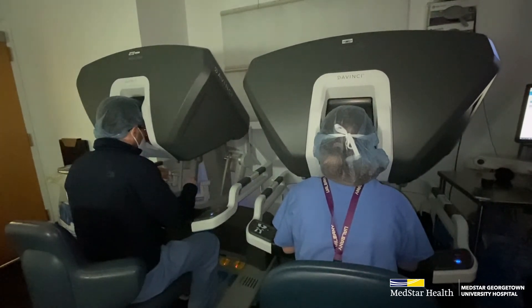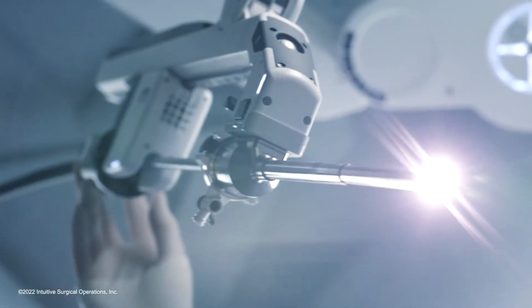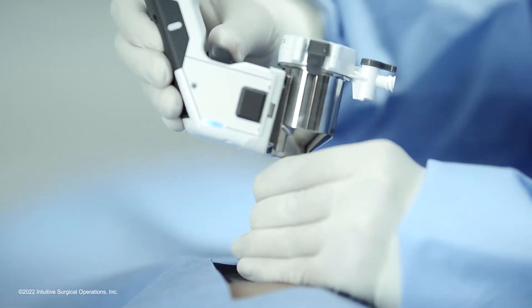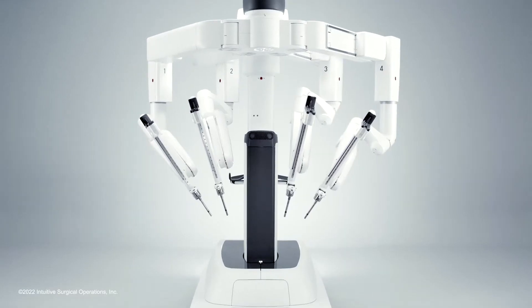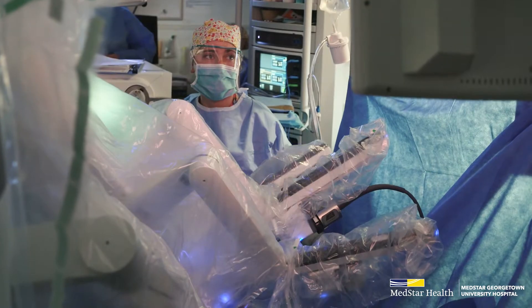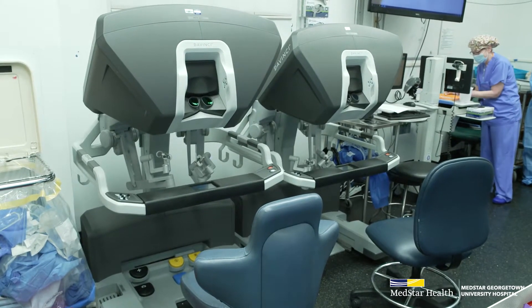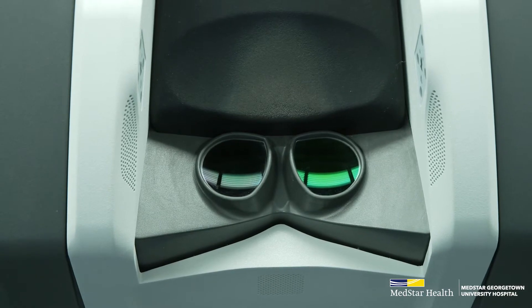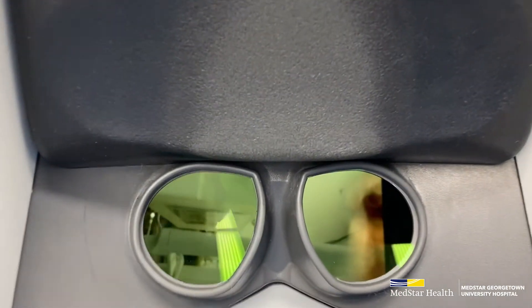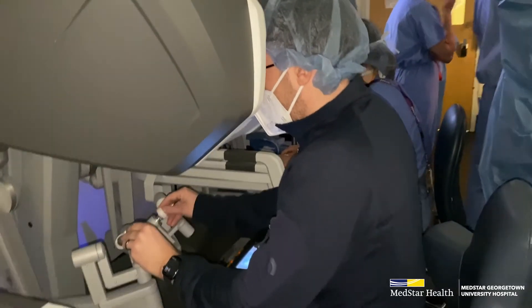The robot arms are in the patient and we have full control over what they do. One is used for a camera, so that's how I see. Two of them are used for my main two hands for dissection, and then the third or fourth arm is used as a retraction device at the bedside. There's also the second part of the robot where the surgeon sits — that's the console. The robotic camera has two lenses, one for the left eye and one for the right eye, and that's what gives us a three-dimensional view. That's where we actually control the robot.